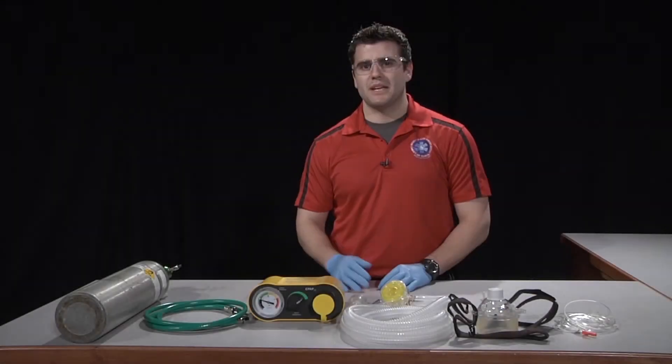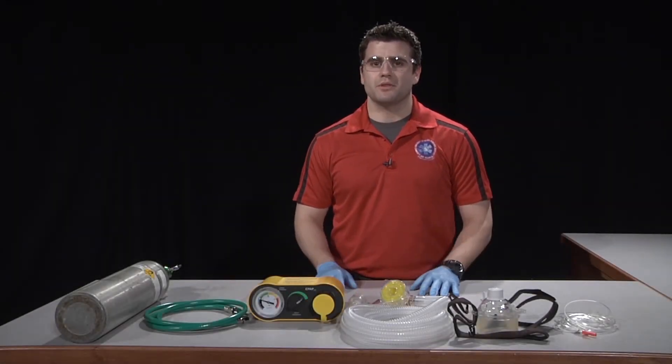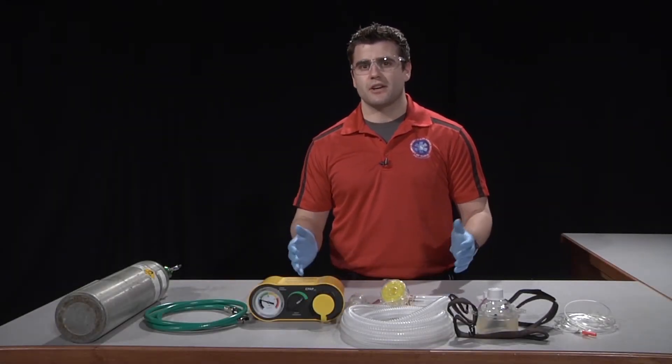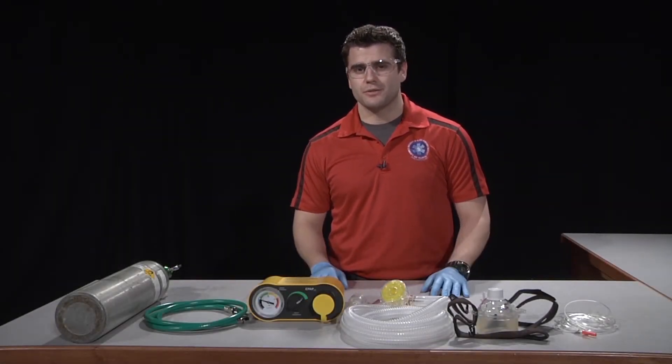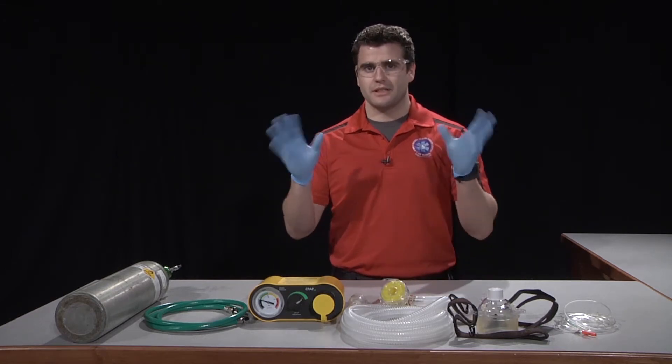This is the CPAP and PEEP skill. Our first step is going to be to take our standard precautions. For this skill, we'll need eye protection and gloves.